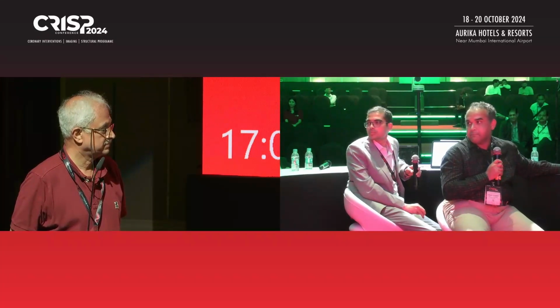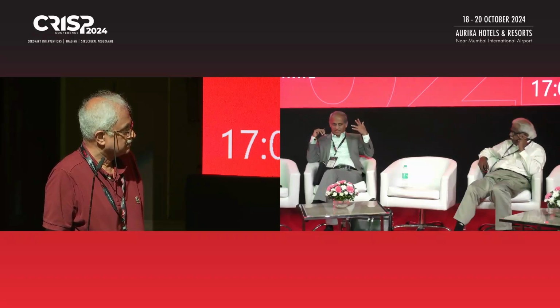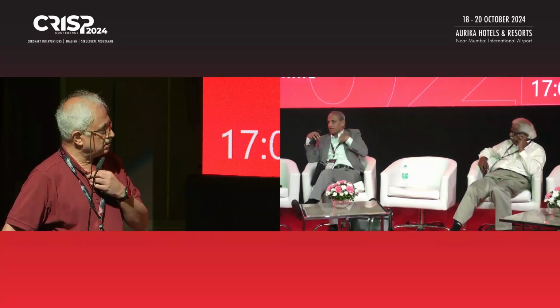And I won't advise this technique to somebody who has not done a couple of hundred ASDs before attempting these techniques. About that, you can do it in RSPV also, you mentioned, but at least I thought I either heard or saw this one. Zaid Amin advises, he wrote the original thing, right, about that baseball shape or whatever they call it. No, really. So he says don't do it in RSPV, although I've been doing it. But is there any objection to doing it in RSPV?